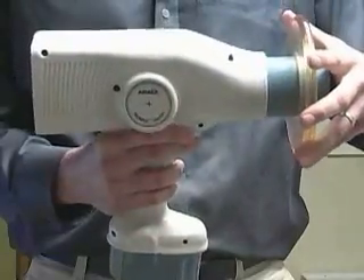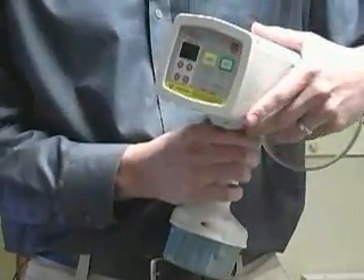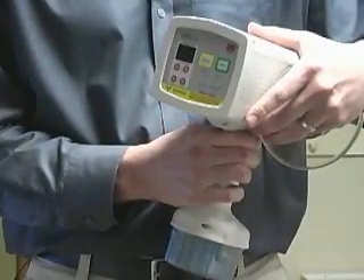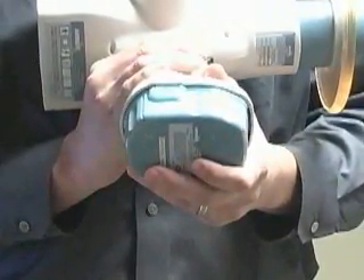It has a backscatter shield in the front. The back has a convenient touch pad where you can change exposure times from .01 to .99 seconds. With the 18 volt battery on the bottom, you get a total of 200 to 300 images from one recharge.